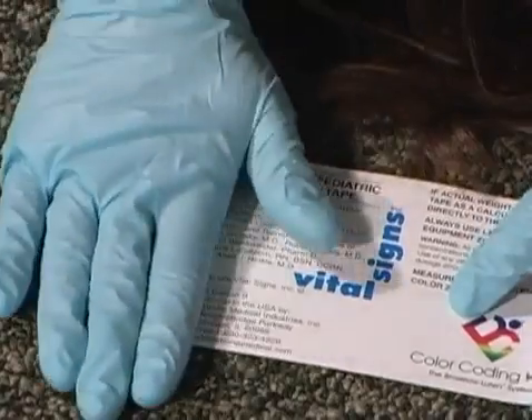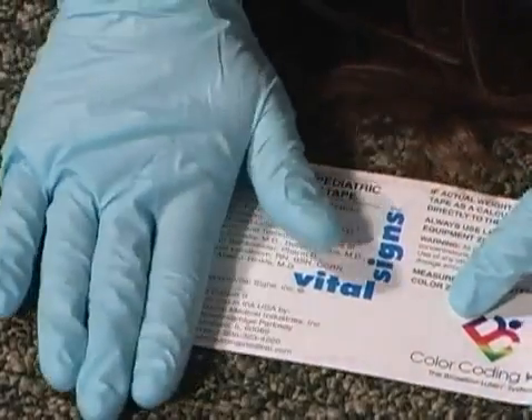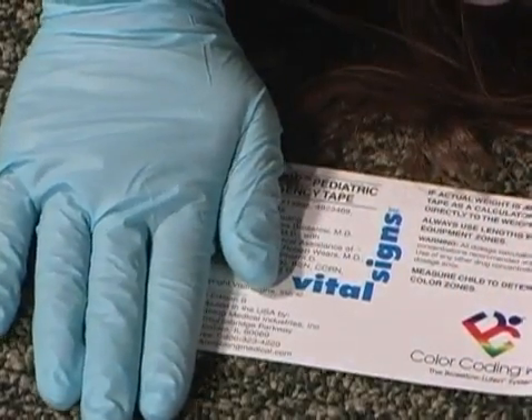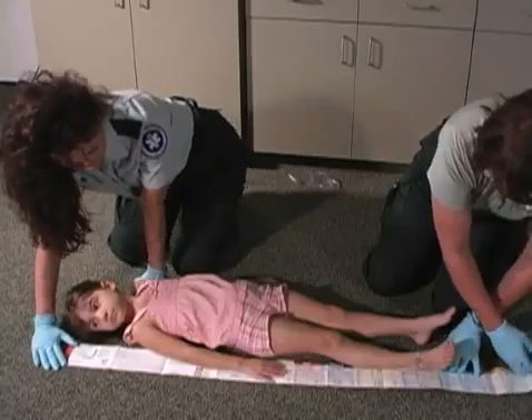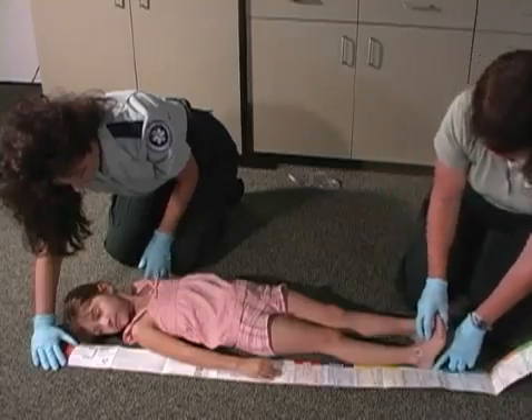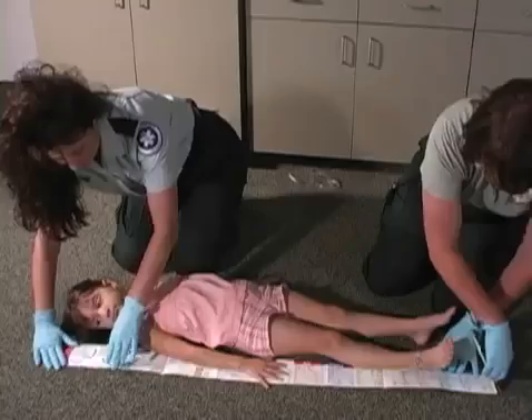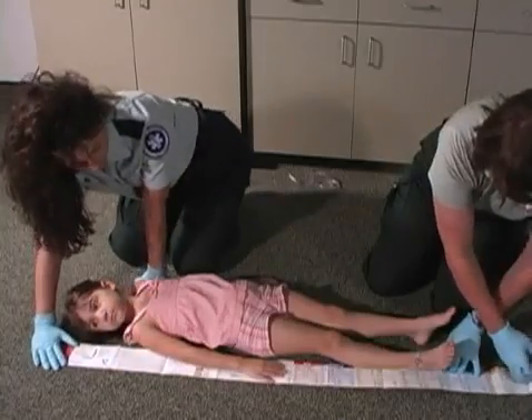To easily find the beginning of the tape, remember: red to head. Secure the Broselow Tape with one hand holding the red section at the top of the patient's head. With your other hand, stretch out the tape alongside the patient's body. While measuring, it is important to maintain proper placement of the tape at the head of the patient. You may have someone assist you if necessary.